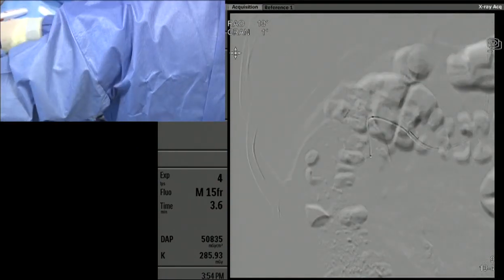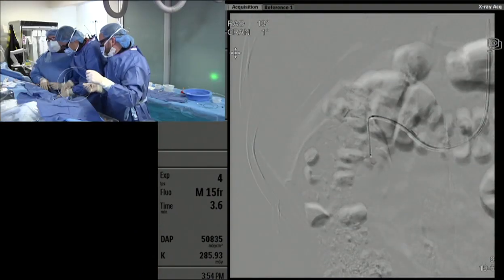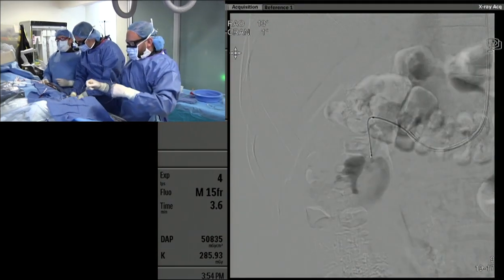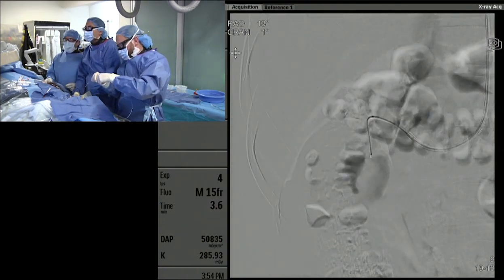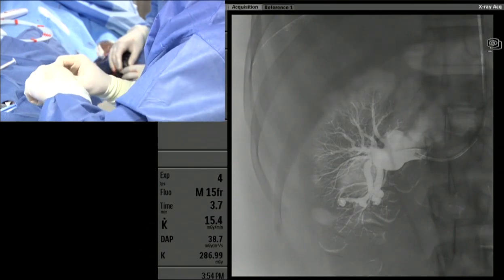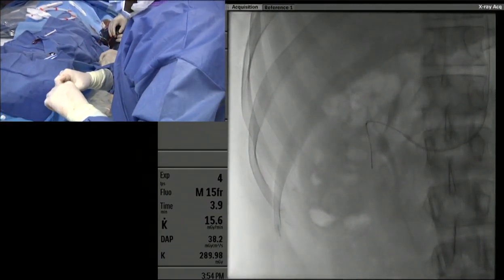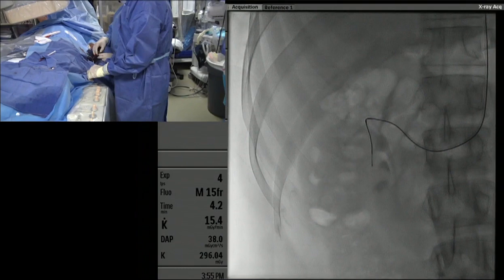So what we're going to do now, and I think unless anybody has a big problem with this, since we have a high flow catheter, what I'd like to use is a packing coil, which is basically like a long noodle, and we're going to push this in and see where it lands. It's fully detachable, so we don't have to leave it in if we don't like it, but I think this might be a good way to create some sort of scaffold for whatever we decide to do after this. So this is a 30 centimeter coil. This is a Penumbra packing coil. It's a thicker coil than what we're used to for microcoils.